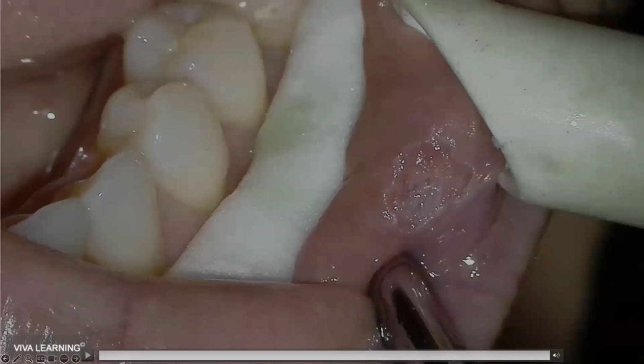That is going to bleed irrespective of whether or not you're using the laser. Now, the great thing though is that you can use the laser to sculpt that tissue back down to healthier levels and paint that away. But generally, if I see bleeding, it's because there is already usually some inflammation going on with that. So I hope that helps to troubleshoot that.